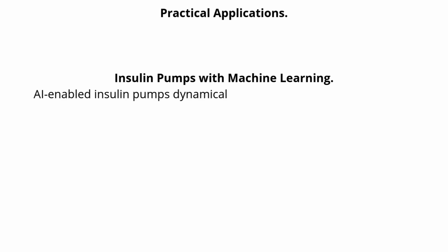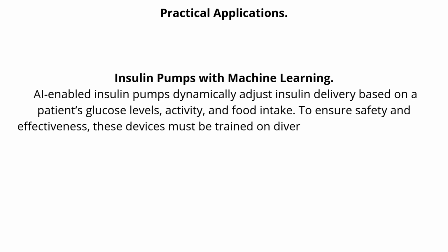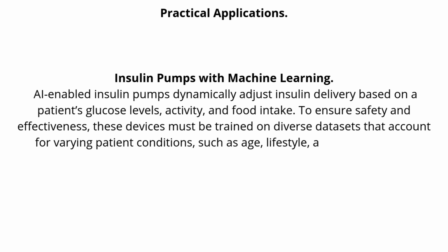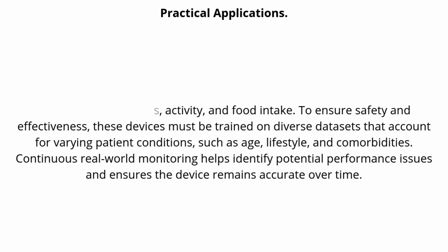Practical applications. Let's look at some practical applications of these principles in real-world scenarios. Insulin pumps with machine learning. AI-enabled insulin pumps dynamically adjust insulin delivery based on a patient's glucose levels, activity, and food intake. To ensure safety and effectiveness, these devices must be trained on diverse datasets that account for varying patient conditions, such as age, lifestyle, and comorbidities. Continuous real-world monitoring helps identify potential performance issues and ensures the device remains accurate over time.